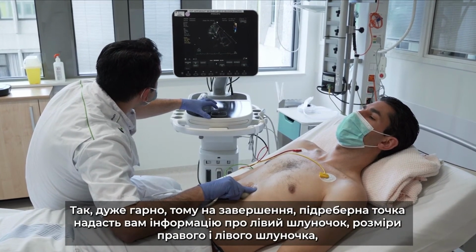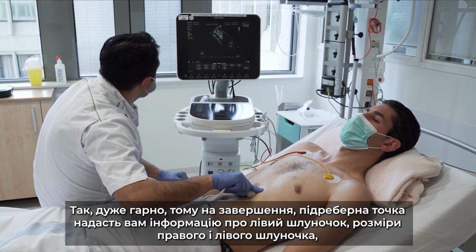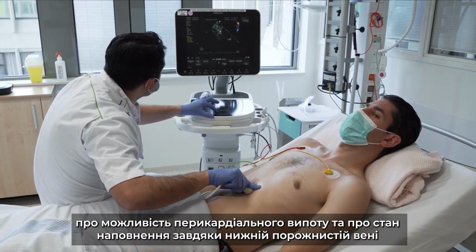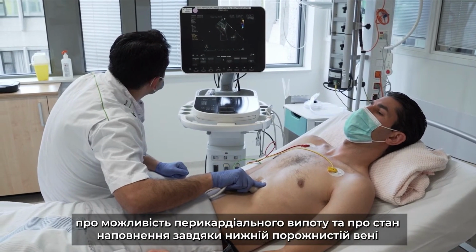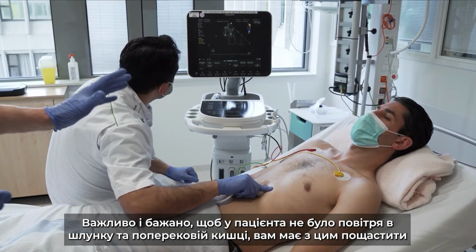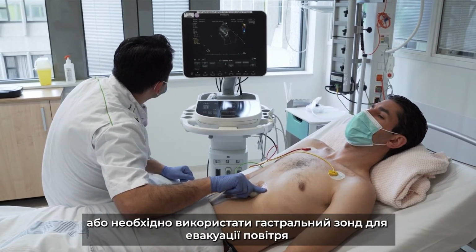Yes, very nice. So in conclusion, the subcostal view will give you information about the left ventricle, right ventricle dimensions, about the possibility of a pericardial effusion, and about the filling status thanks to the vena cava inferior. It's important, preferably, that the patient does not have air in the stomach or the colon transversum. So you have to be a little bit lucky. Sometimes we first put in a gastric tube to get the air out.